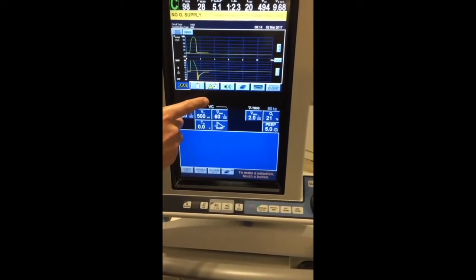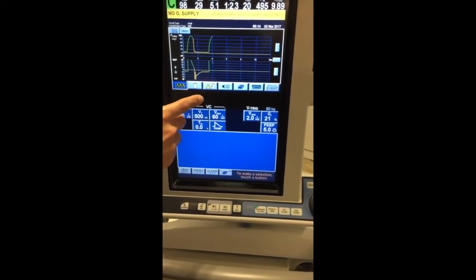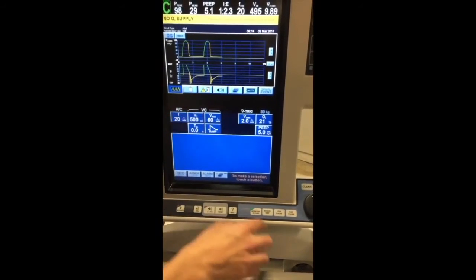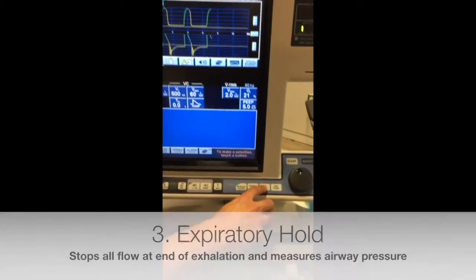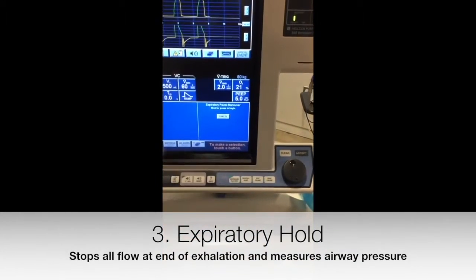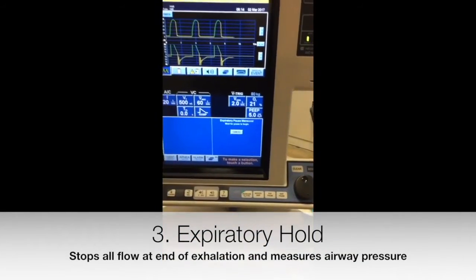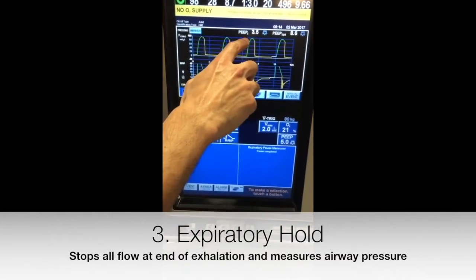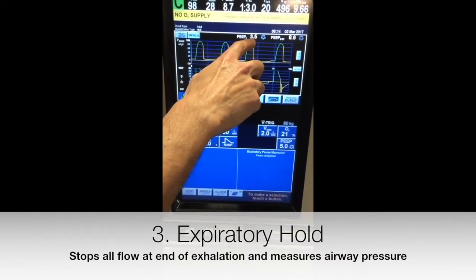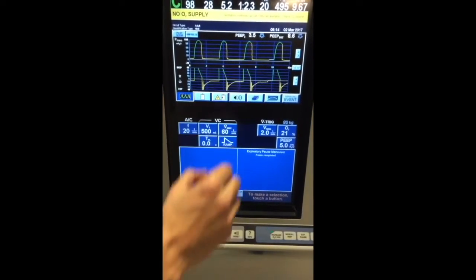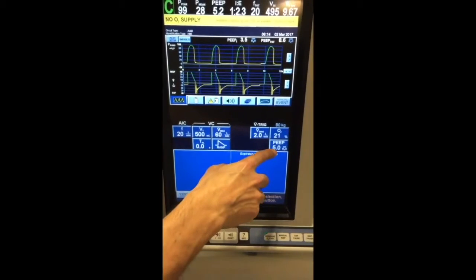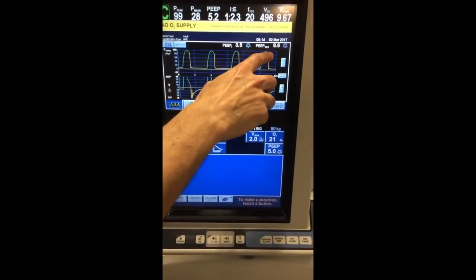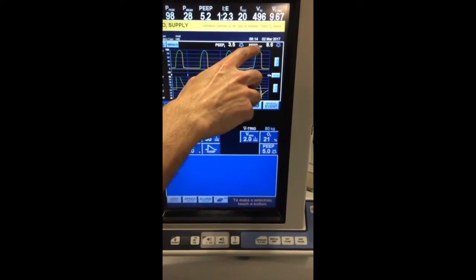The last way to measure auto-peep is by actually doing the expiratory pause maneuver by pressing this button here, which will calculate intrinsic or auto-peep for you. Here it's about 3.5, which is in addition to the PEEP that you've set at 5, giving you a total PEEP of 8.6.